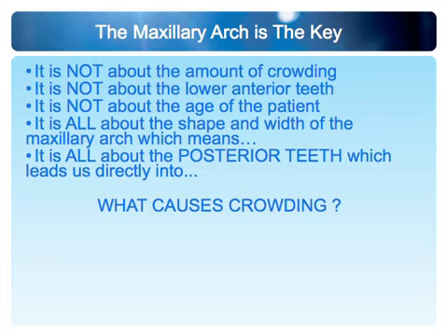So part of what we are determining when we unravel these secrets to Invisalign case selection is the focus is on the maxillary arch to determine if we have proper form and width. And if we don't, then it's amazing how much crowding we can unravel with very little to no IPR. And if there's one thing that you could do to your life to simplify your Invisalign treatment, we know it would be to eliminate the IPR altogether. So we're going to take a look at how this helps us do that.